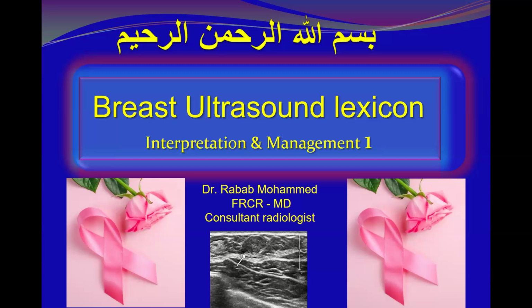Hello everyone. I'd like to welcome everybody to today's session. We are going to start a new lecture series discussing breast ultrasound interpretation and management based on the ACR lexicon.